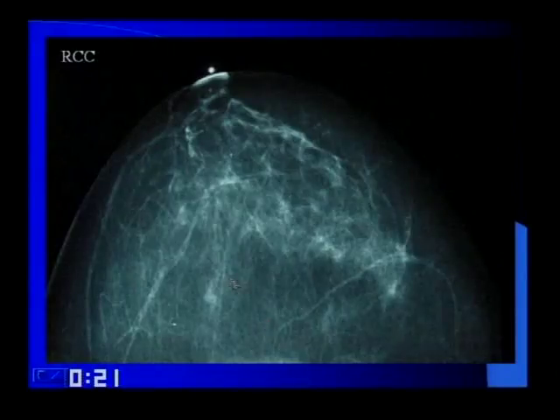Okay. And so this was a spot compression view of this area right here. Okay. And so on one view, we have what looks to be a focal density with punctate calcifications. They're pleomorphic. And I'd like to see them in at least one other view and possibly a 90 to see if they layer. But the point is I have a density underneath it.